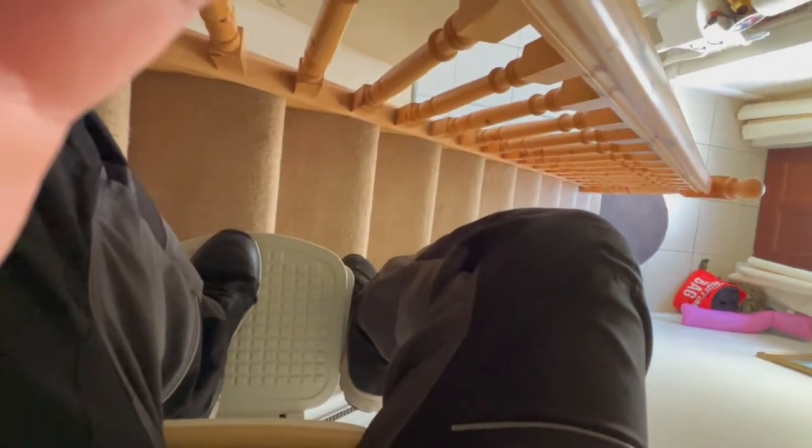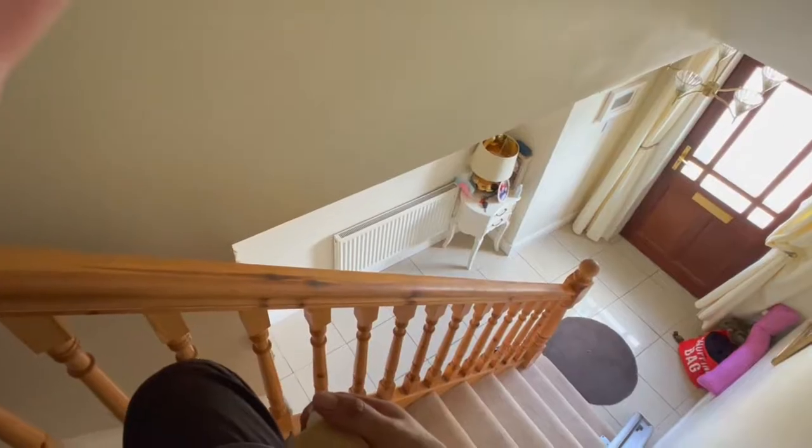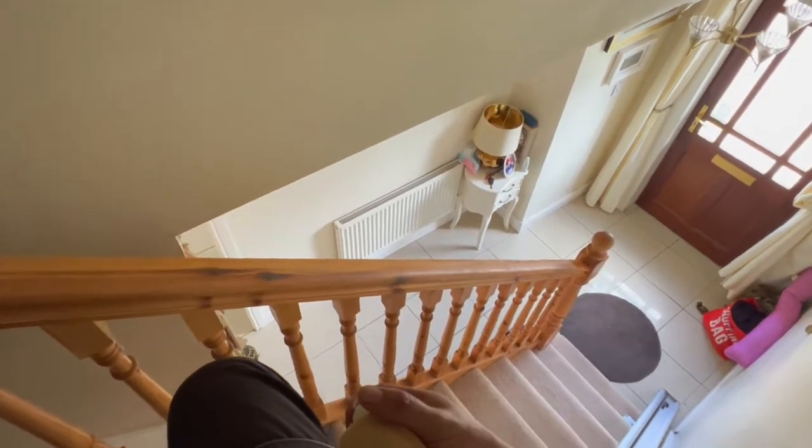I'm now going to demonstrate traveling downstairs on this stair lift, so I'm going to push and hold the direction I want to go and away we go. There are also safety sensors on this, so if a foot was there it would automatically stop, and it will show a code on the display. Once again it's stopped automatically.